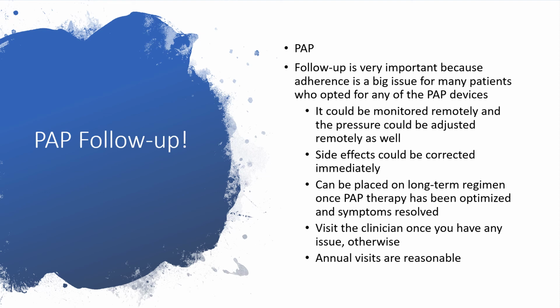Maybe they don't know that remotely it could be monitored, and they will know that it was not applied. The side effects could be corrected immediately. It can be placed on a long-term regimen once PAP therapy has been optimized and symptoms resolved.